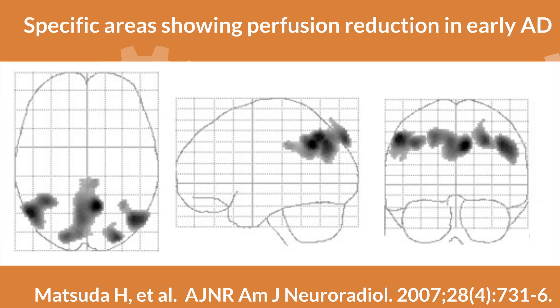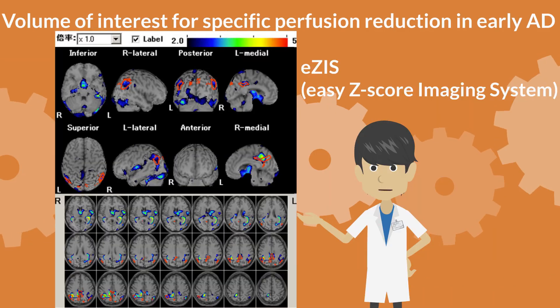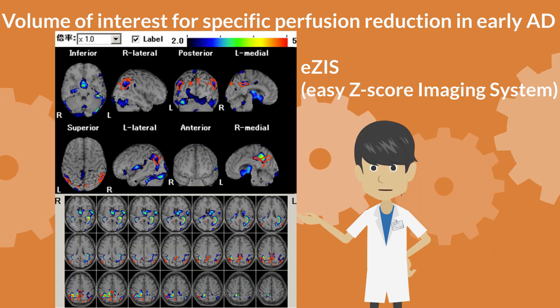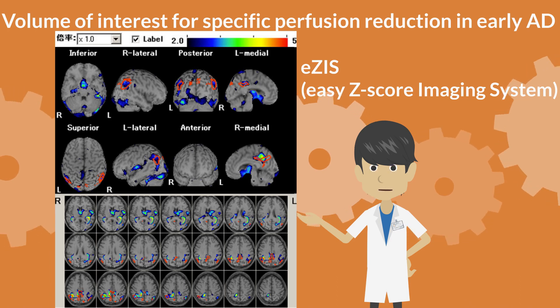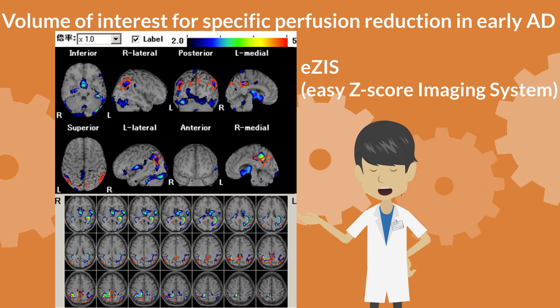Statistical brain imaging analysis using statistical parametric mapping (SPM) detects areas of significantly reduced cerebral perfusion in the early stages of Alzheimer's disease, showing significant decrease in the bilateral inferior parietal lobes, posterior cingulate gyrus, and precuneus. In the EZI statistical image analysis system, the areas of reduced cerebral perfusion specific to early Alzheimer's disease detected by SPM are surrounded by red lines.